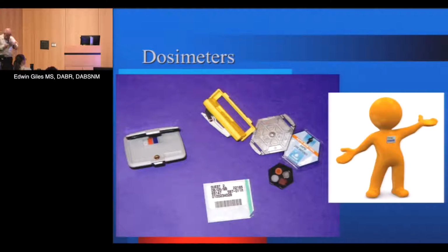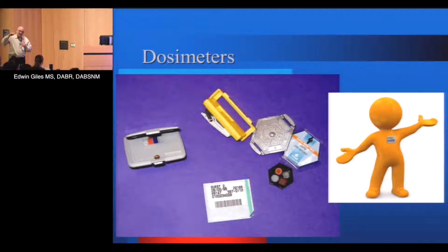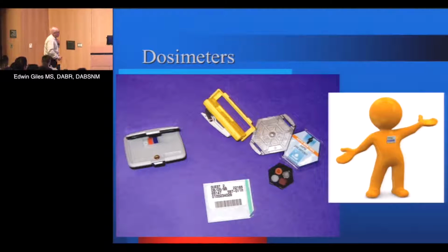When we look at dosimeters, okay, the dosimeters we're typically going to wear in this region here. If I'm wearing a lead apron, I need to remember to put the dosimeter outside of the lead apron. So when I'm working around the radiation, I get exposure, that exposure is measured, and I'm going to have some number, say it's 100 millirem. The radiation sensitive organs actually do not receive the 100 millirem, they receive 1 to 2 millirem because of the lead apron use. So when we look at our badge reports and we see a number, assuming I wear my badge at the collar region, it's actually an overestimation of the actual dose that I receive. So we can keep in mind, even though I show to have 100 millirem, in fact, the dose to my radiation sensitive organs is much less.